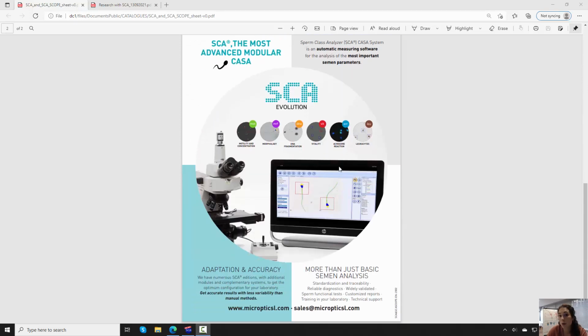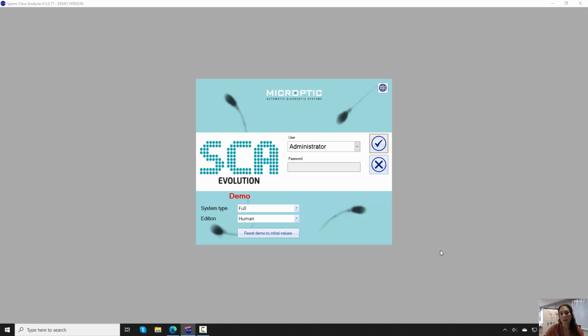So for this, I will open the software and make a demonstration of it. This is the SCA Evolution software. This is the first screen that you can find, and it allows you to choose the user that is going to work with the system.